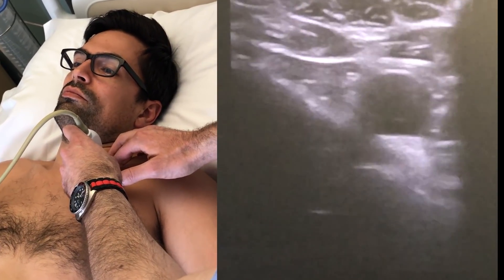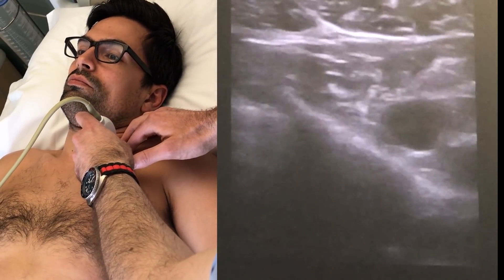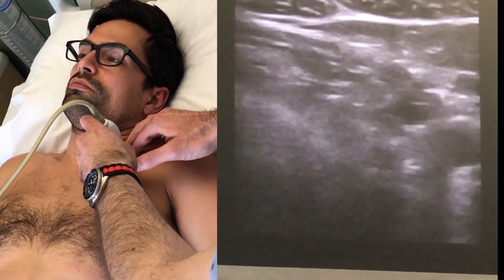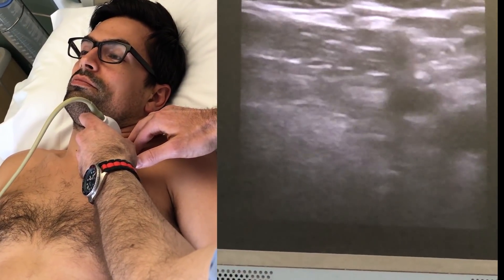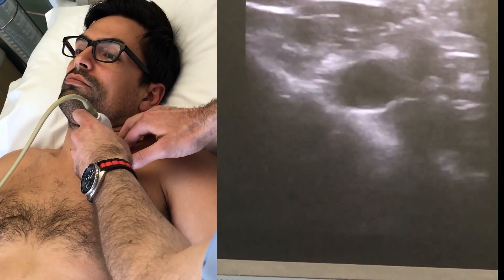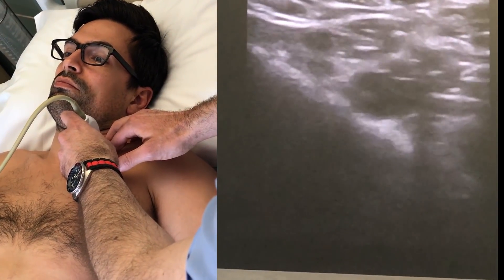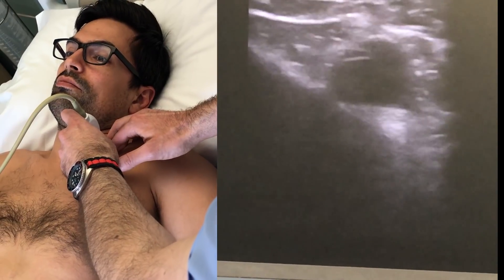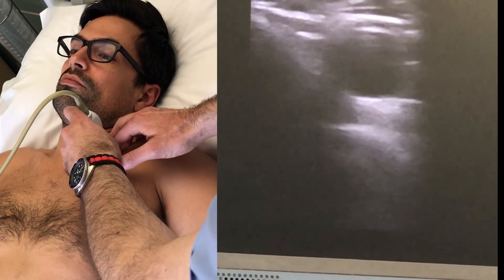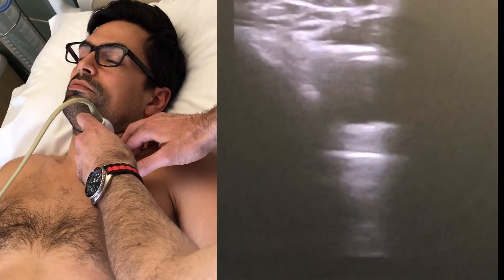This tracks inward. If we go laterally a bit, we can start seeing a little lung here. In order to differentiate between lung and bone, you need to hold the probe really still and see if there's lung sliding behind it or not. That actually looks pretty good — that's a nice bone signal there. It's bright, there's nothing moving behind it, so I think I'd be happy with that.